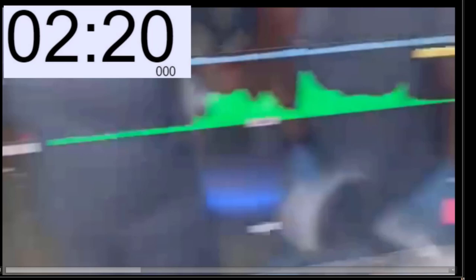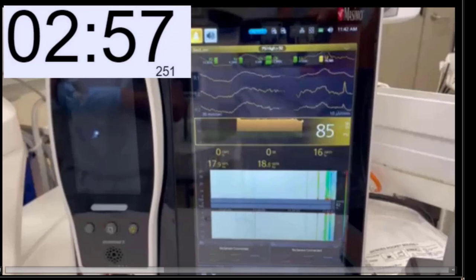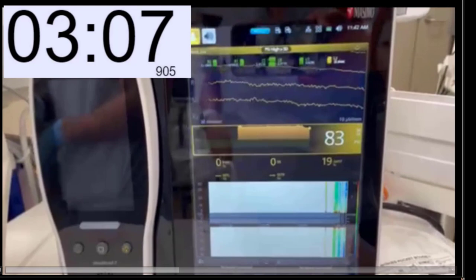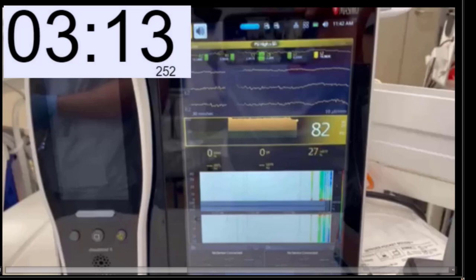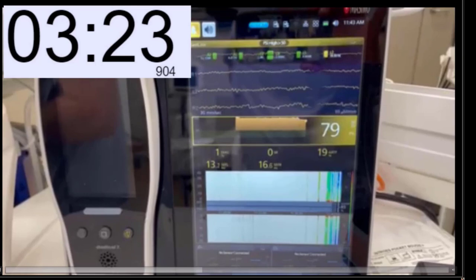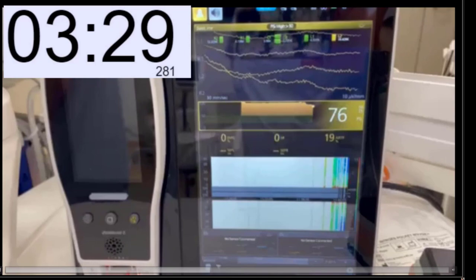Now I'm going to start dialing down my plasma target in this elderly patient because I don't want to overshoot and over-anesthetize this patient. Our effect compartment will still slowly keep rising to that level of 2. Here we can see our nice blue color appearing, the slower frequency waves, and our number is still going down. We have a number of around 86 but you can definitely see the color spectrum changing as the brain waves are going more to the slower frequencies. At three minutes, a very nice spectrum of color is happening there, even though our number is still static at 82.